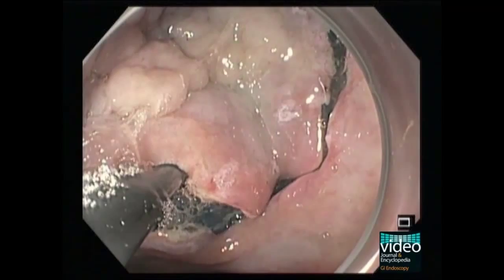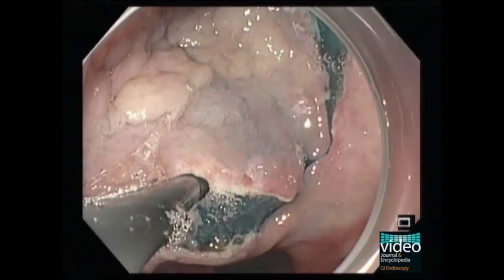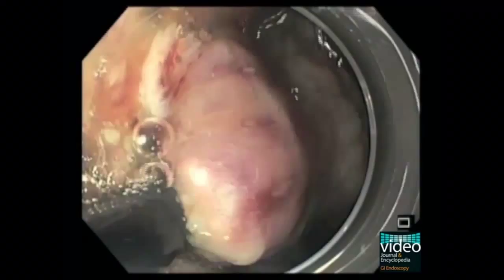We can see that even using a cap and subepithelial injection, the visualization of the dissection plane is difficult, turning the ESD procedure more prone to bleeding and perforation.